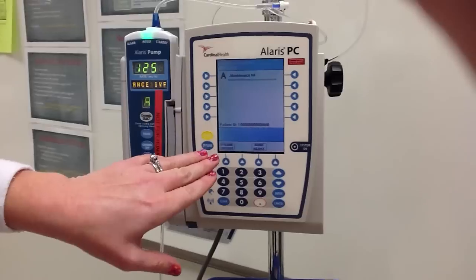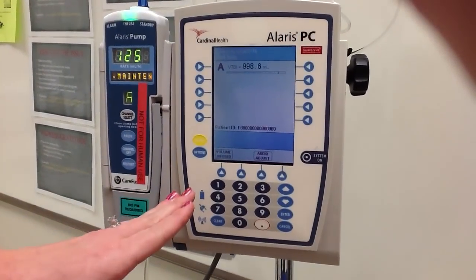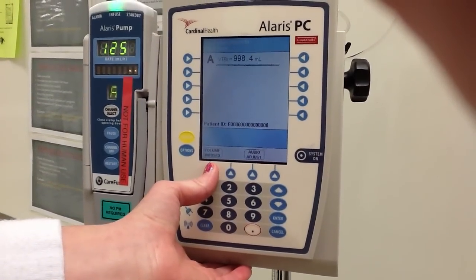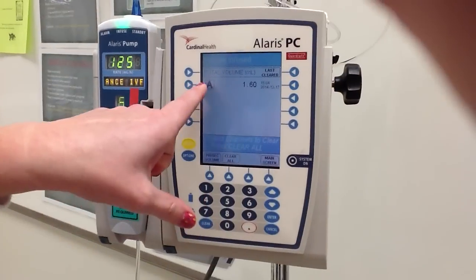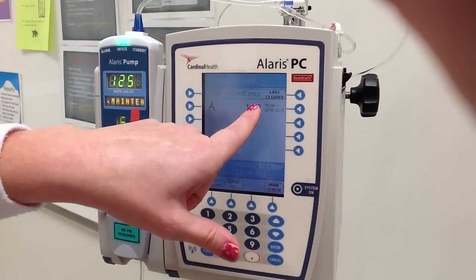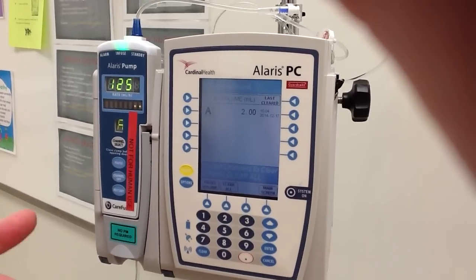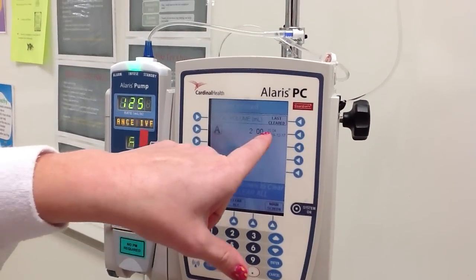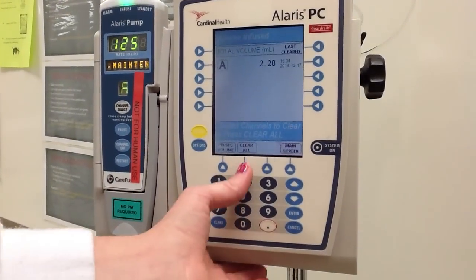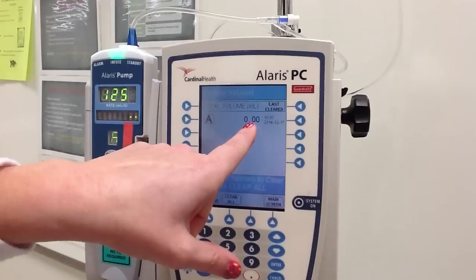Now that the IV is running, if I want to check how much volume has infused — which you'd want to do at the end of your shift — I'm going to touch the volume infused button. It's going to tell me that for channel A, I have had 1.80 mLs run. Typically it would be more based on the length of time. If I want to clear it, I can hit clear all, and it will take my total volume infused back down to zero.